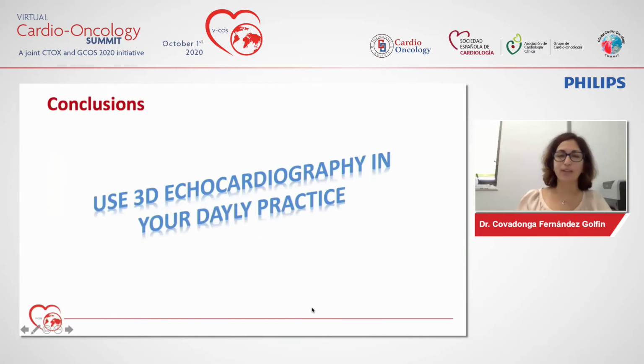And just to conclude, use 3D in echocardiography in your daily practice. It's easy, it's fast, it's more accurate, it's reproducible. It's going to be for the better of your patient. It's going to make you take more confident decisions and make the evaluation and the follow-up of your patient easier.